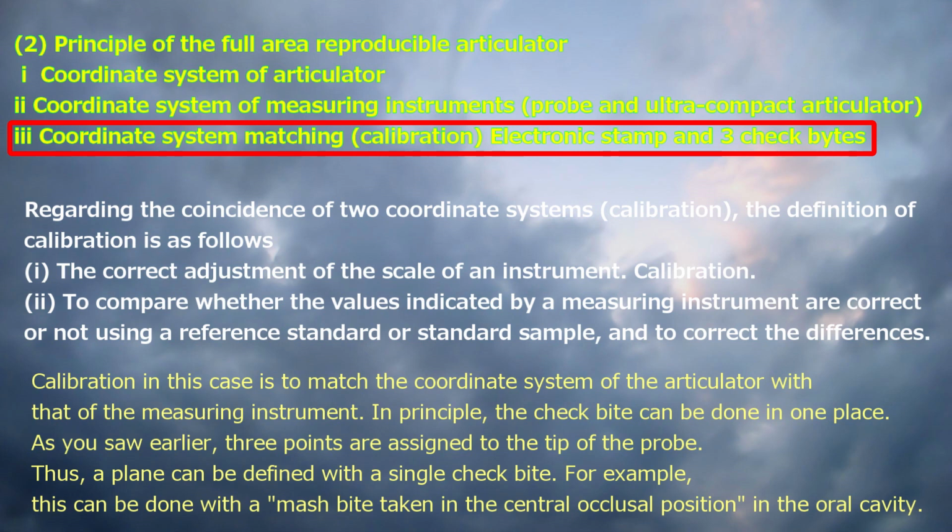In principle, the check bite can be done in one place. As you saw earlier, 3 points are assigned to the tip of the probe. Thus, a plane can be defined with a single check bite. For example, this can be done with a mashed bite taken in the central occlusal position in the oral cavity.